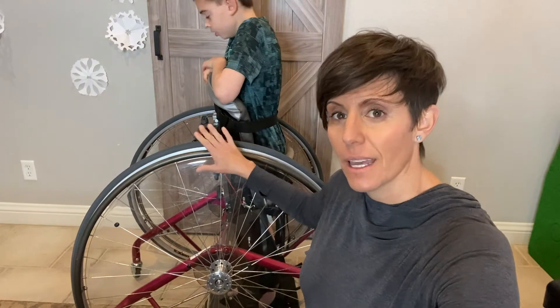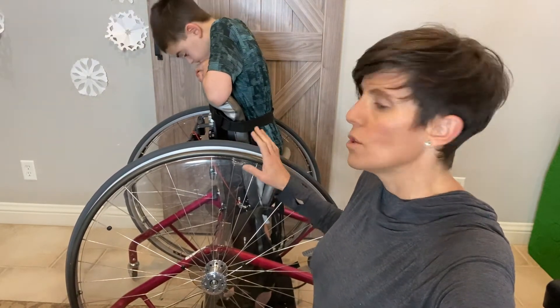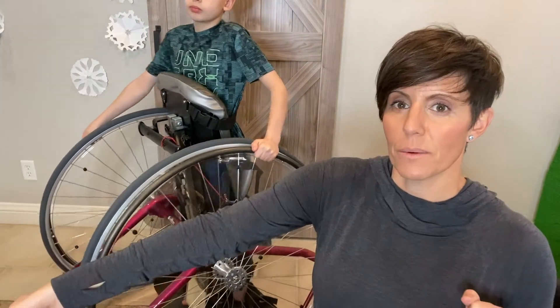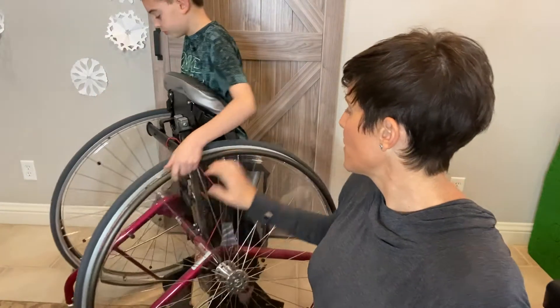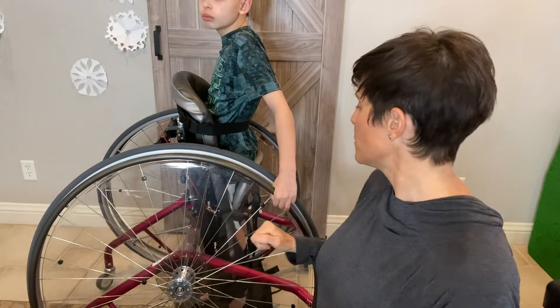One of the most important things to note when teaching somebody wheeled mobility is that just getting them to do anything to develop a cause-and-effect association with the wheels is awesome. We're not really looking for them to go in a straight path or necessarily in the direction we ask. We just want them to start pushing and doing something. Sometimes kids are just going to go in a circle because one wheel goes one way and the other the other way — and that's awesome. There's time to learn how to go straight later, but the first time we teach someone to move, we just need to develop the association: when I do something, the wheels move.